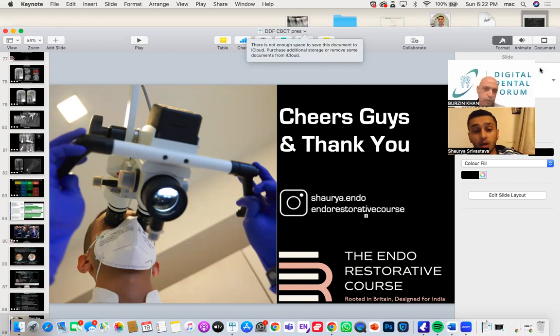True. And post-op scans, there's no place. I mean, there's no need for post-op scans. I take them because I consent the patient for education purposes. Because I talk a lot on CBCTs to understand anatomy, etc., correlating my pre-op to my post-ops. So I take them only when I think there's an indication that some students or clinicians might learn from that. So there's no reason to take a post-op scan.